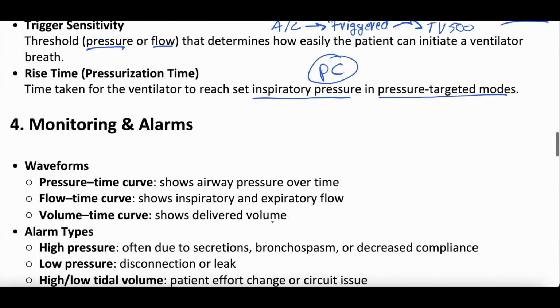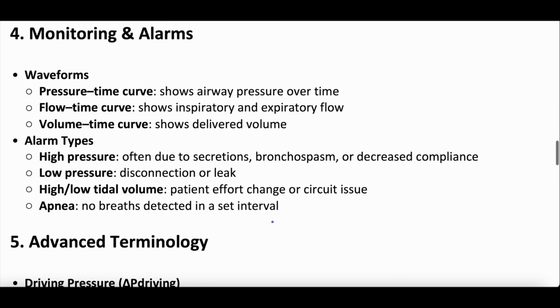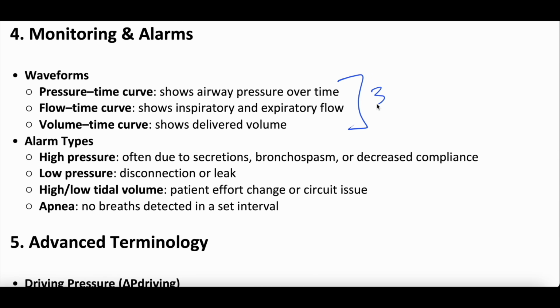All right. Monitoring and alarms. We're going to fly through this because of waveforms, there are 3 waveforms we talk about. We have episodes on all 3 of these waveforms. The one that's usually on the top is the pressure versus time. The one in the middle is usually flow versus time, and the one on the bottom is volume versus time.